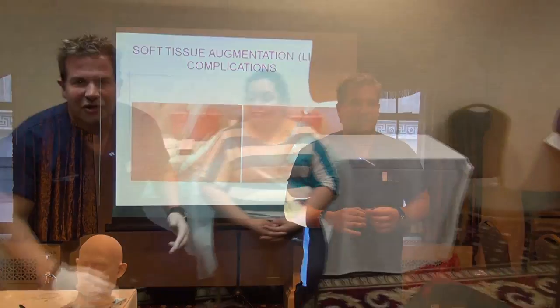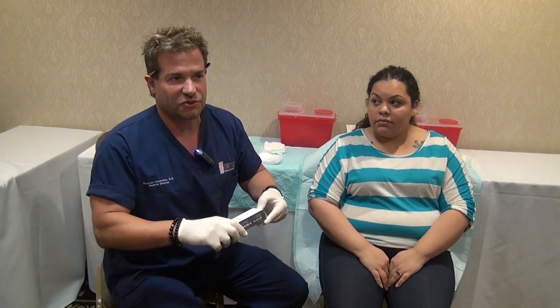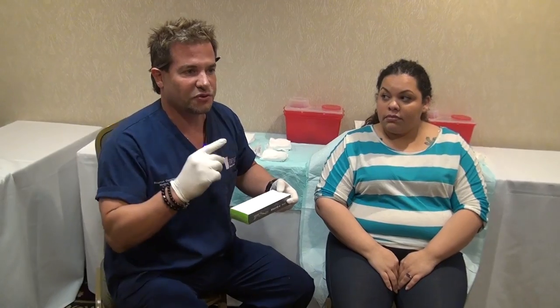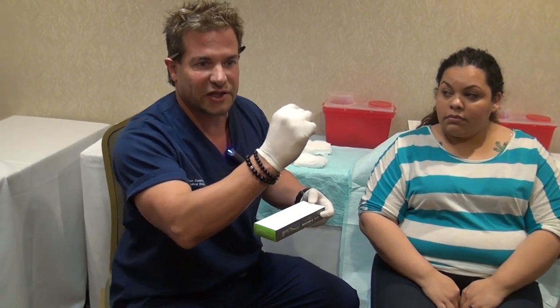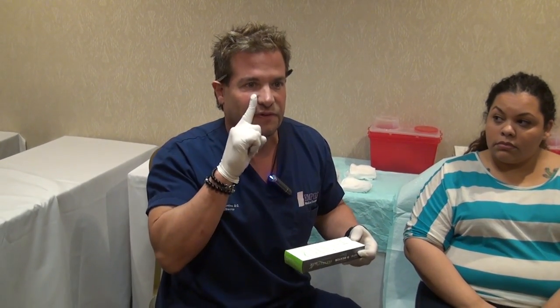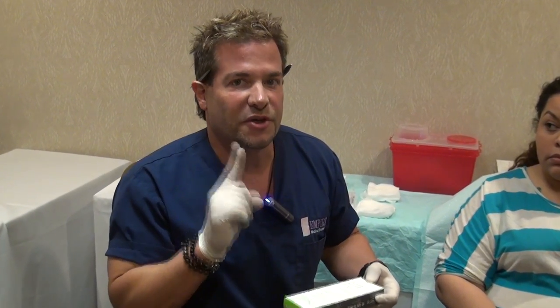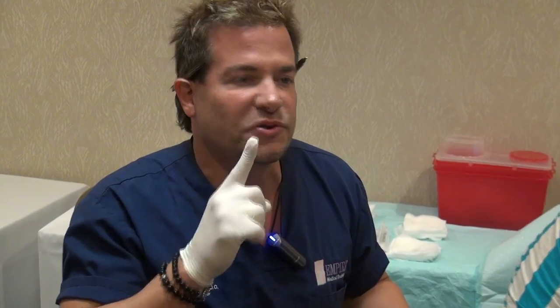We're here at Empire Medical Training and we're going to do a demonstration of a dermal filler — we're going to inject marionette lines. We'll talk about a couple of different techniques. One is the traditional linear threading, where you advance your syringe and needle and lay down a thread of product. The nice thing about demonstrating marionette lines is that you can actually use two or three different techniques on one area.